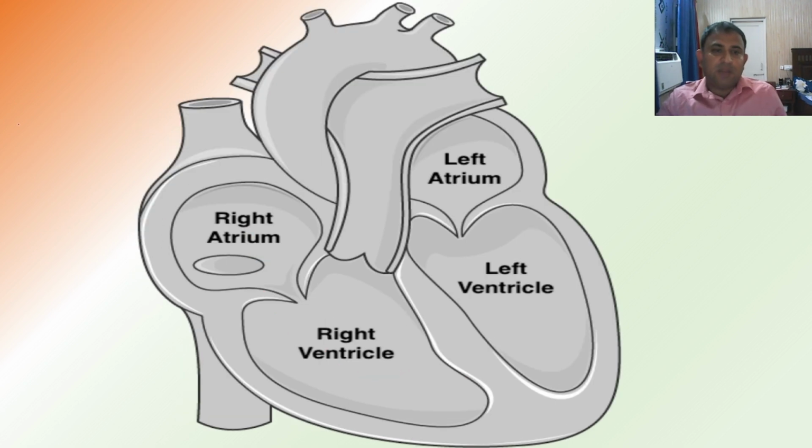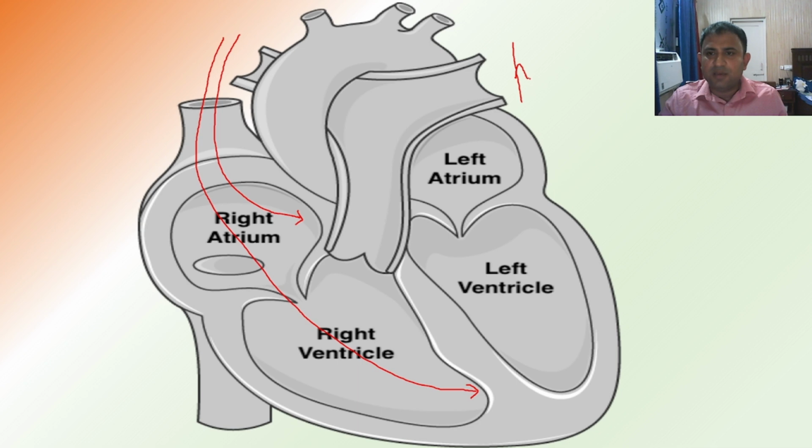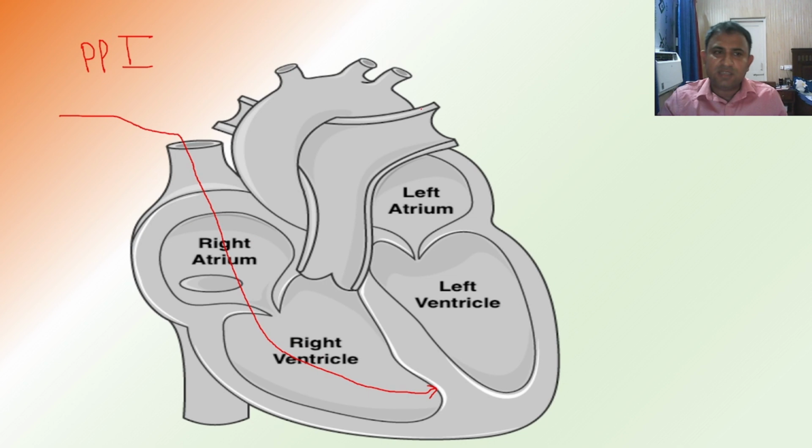The second thing that you can do is program the pacemaker in such a way that there will be one lead which will be sensing the demand of the atria, that is, sensing the atrial rate, and then subsequently pace the ventricle by giving a pacing beat. So every atrial beat will be sensed, there will be a sensing spike, and then there will be a pacing spike, and then a ventricular beat. So the ECG will look something like this.